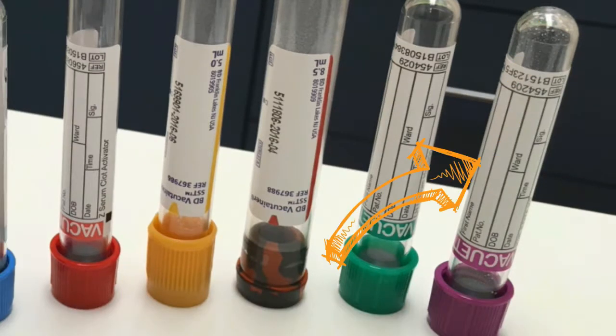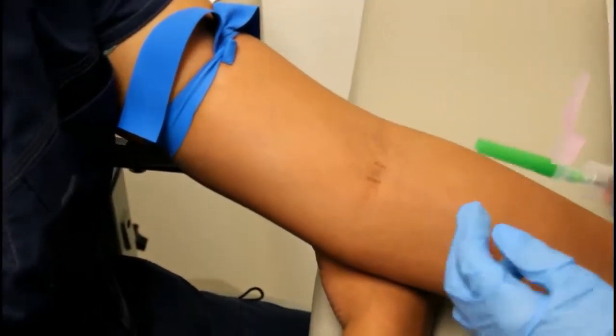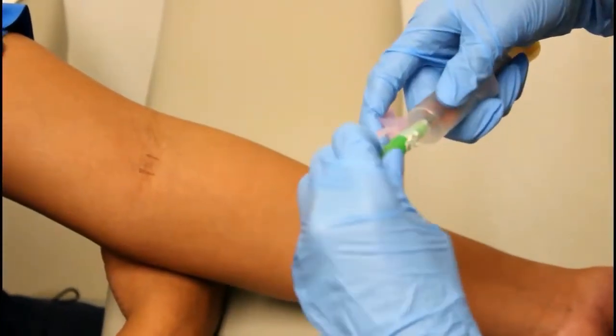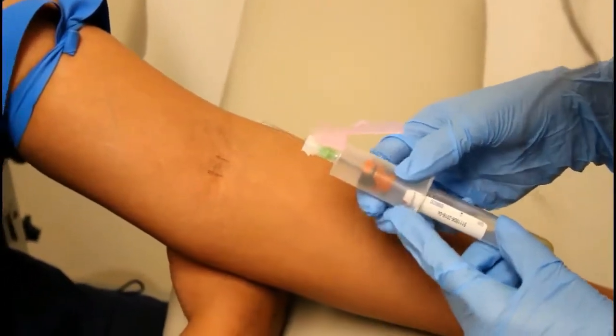The purple lavender tube contains the anticoagulant EDTA. It is used for most hematological tests, such as CBC with differential. Now that the collection site is dry, you'll reapply the tourniquet. Today we will be drawing a purple top tube and a tiger top tube to test for TSH, free T4, and a CBC with differential.